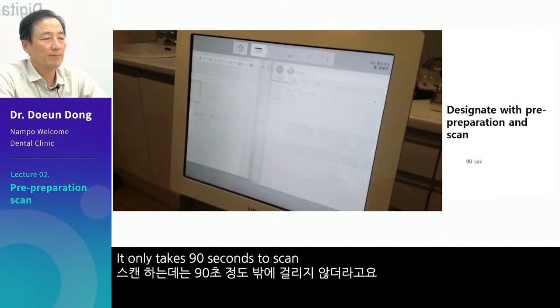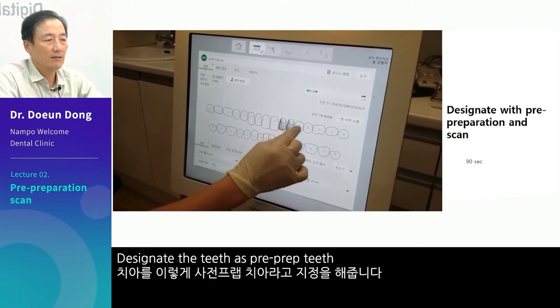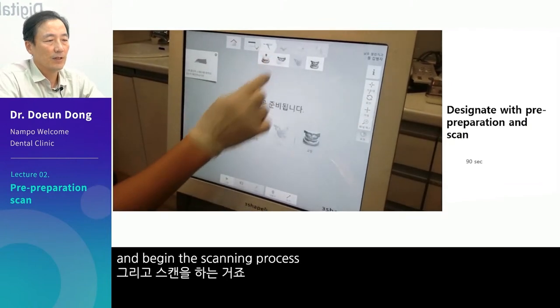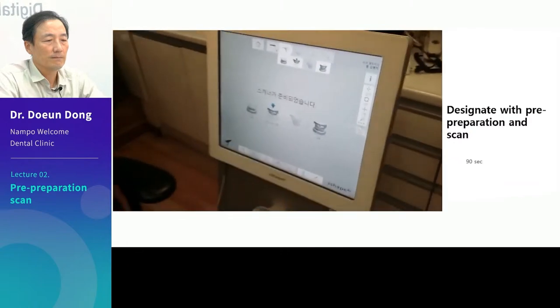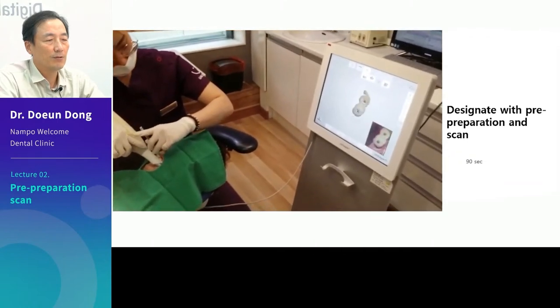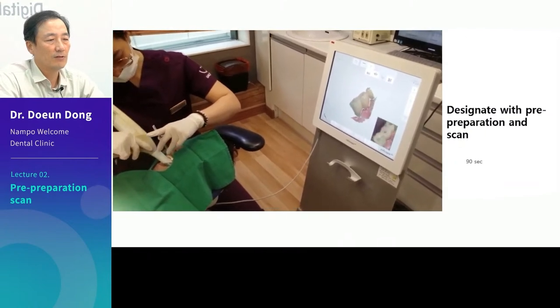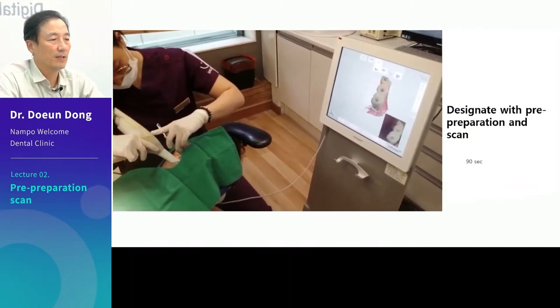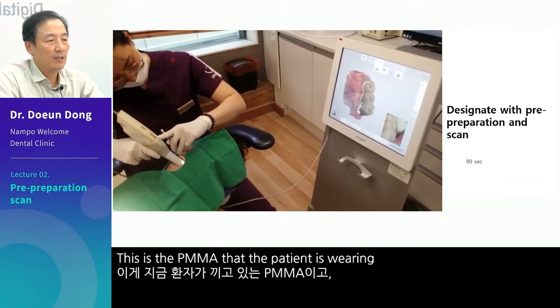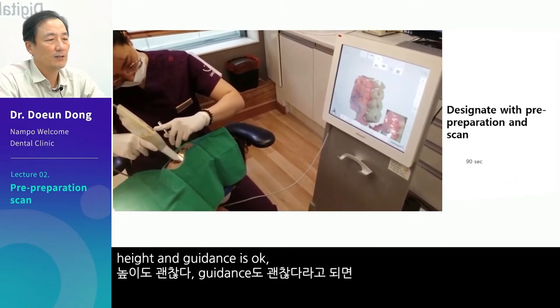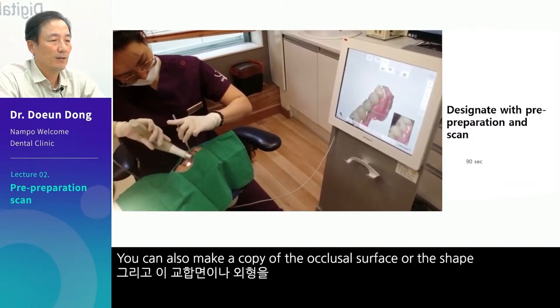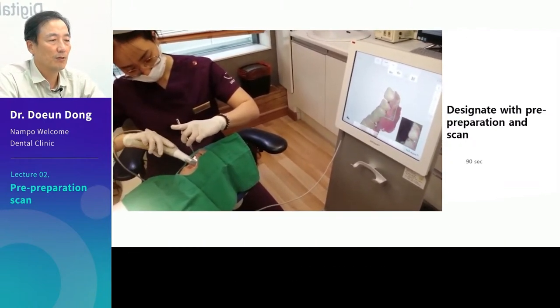It only takes 90 seconds to scan. Designate the teeth as pre-prep teeth and begin the scanning process. This is a faster way of merging compared to the merging process in the lab, and it is also technically convenient. This is the PMMA that the patient is wearing. If the patient thinks it is comfortable, height and guidance is okay, then you can scan it as is. You can make a copy of the occlusal surface or the shape into the final prosthesis.